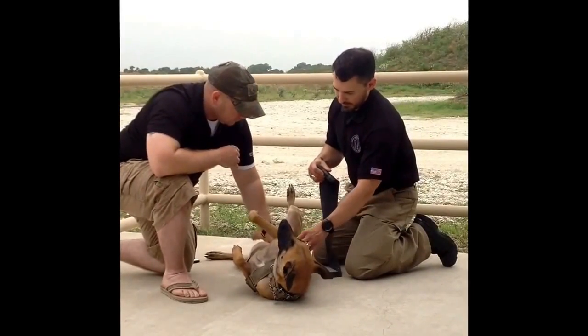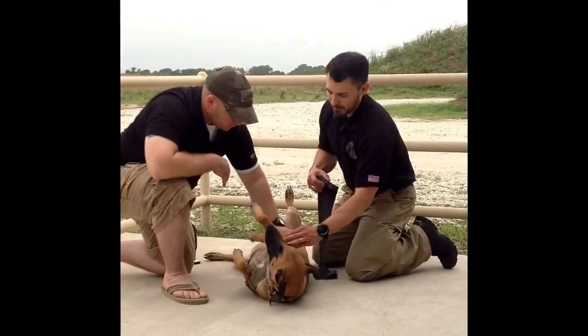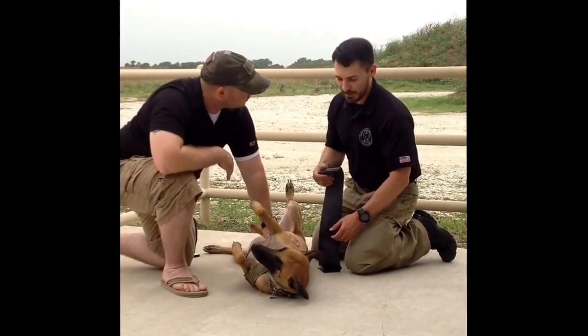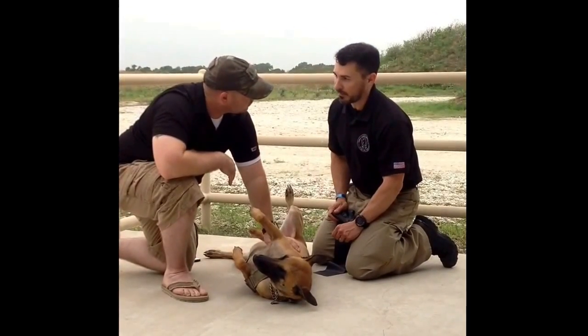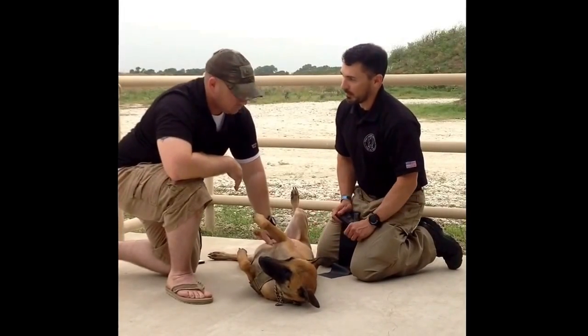With any Izzy bandages, halos, or anything like that for penetrating chest trauma, try to get the hair out of the way as much as you can. She doesn't have a big thick coat, which is good, but if you're working with a dog like a German Shepherd or some double-coat dogs, a prep razor is going to be a lifesaver just so you can get all that hair out of the way and see where the hole is.